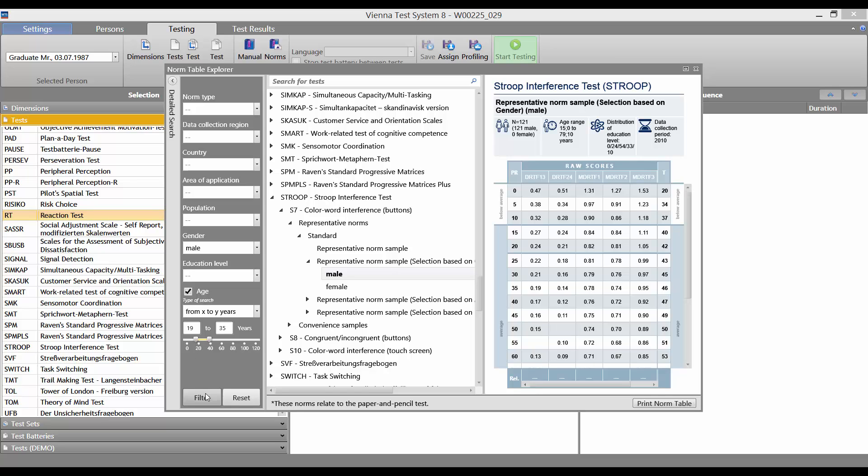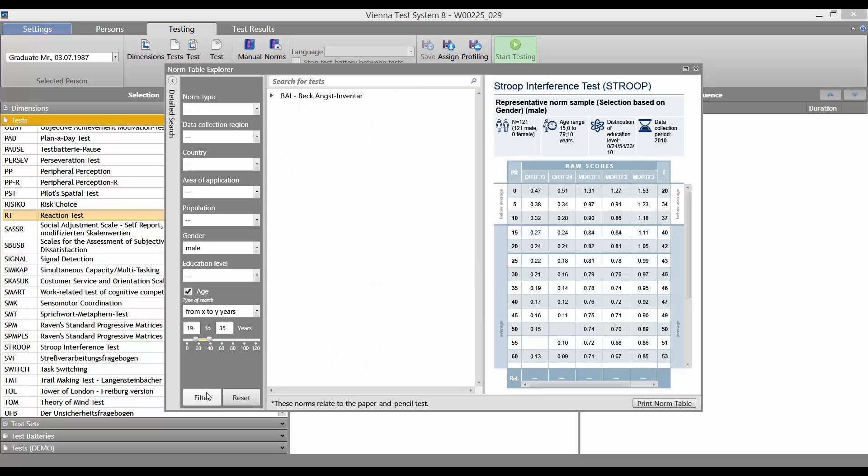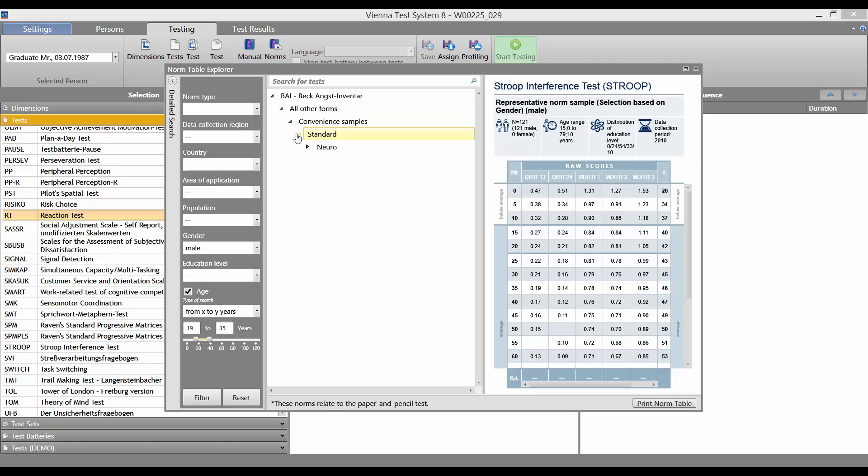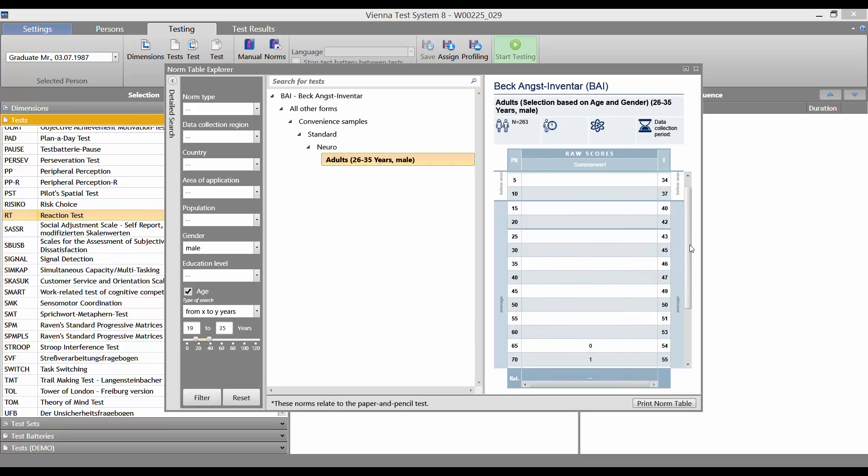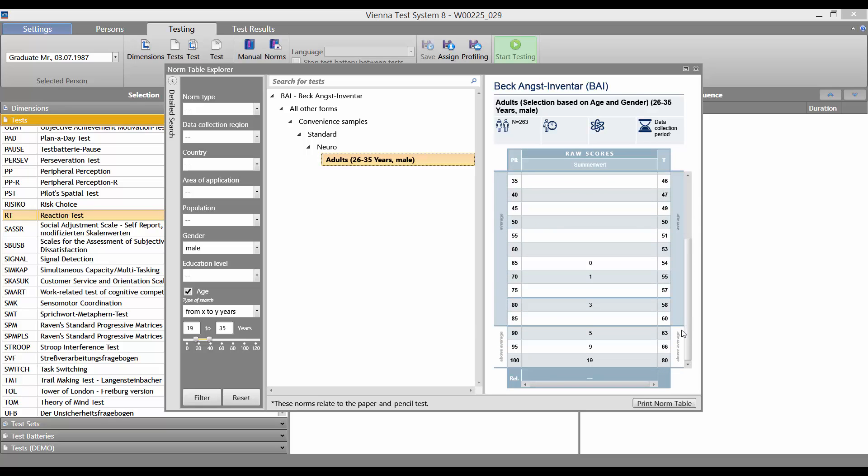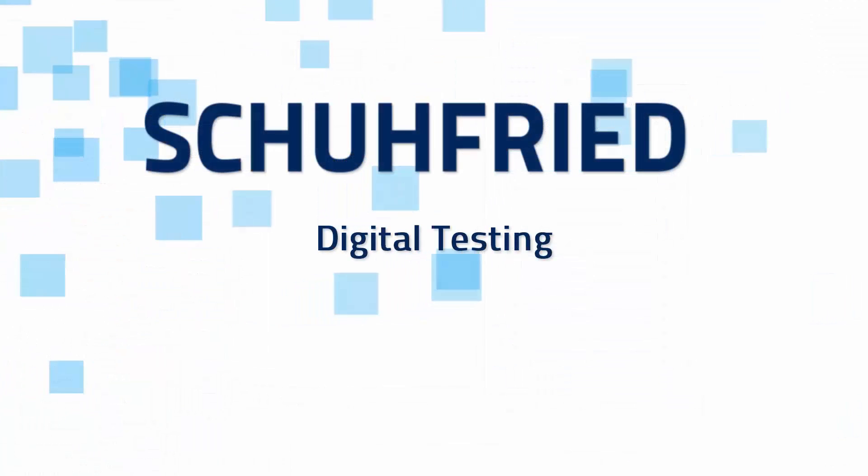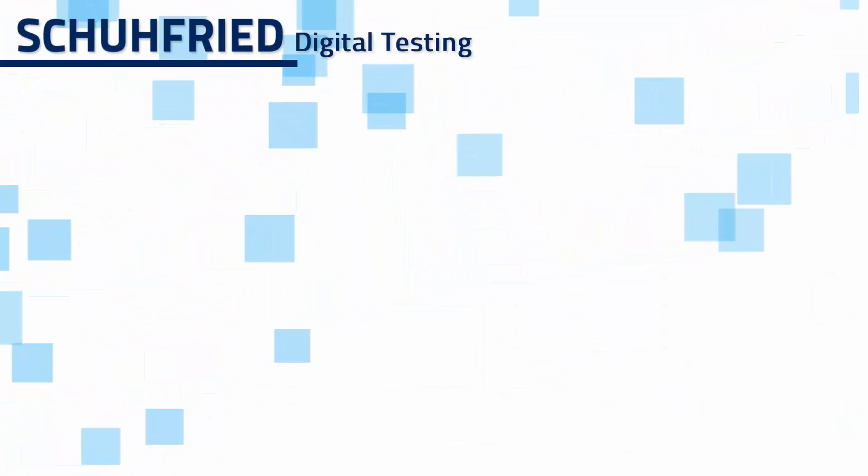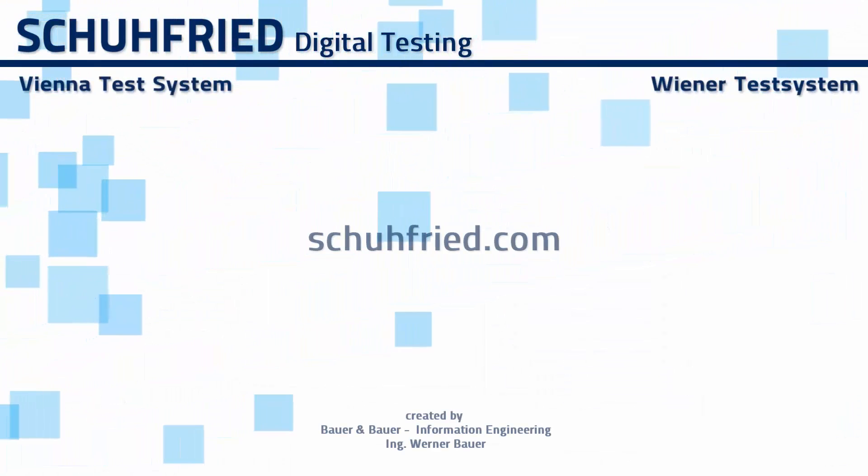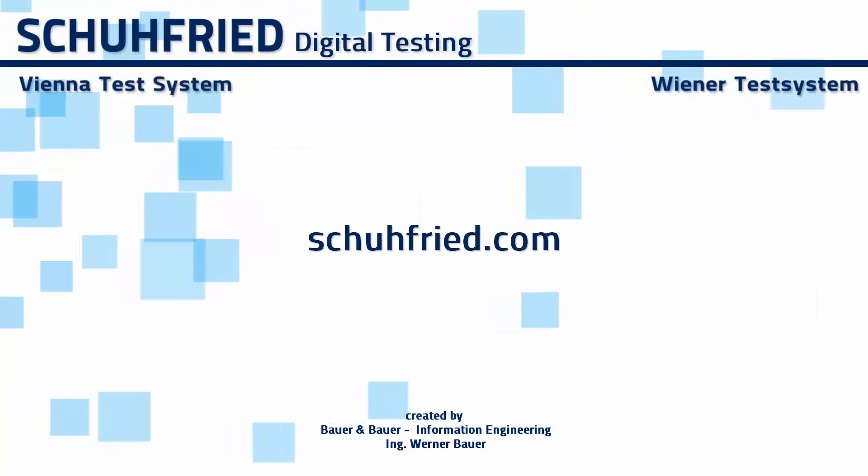Let's click on filter. We then see the results here in the center column. Thank you.